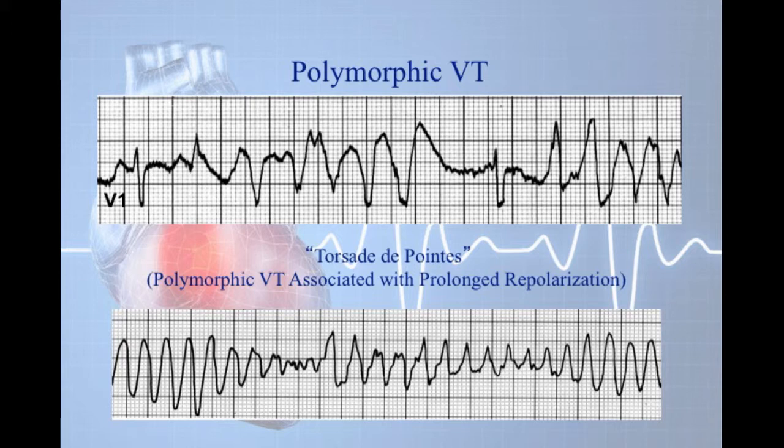If a long QT interval was observed before the patient went into polymorphic VTAC, this is probably torsades. You may choose to immediately use mag sulfate. In absence of a prolonged QT interval, however, the most common cause of this rhythm is myocardial ischemia.